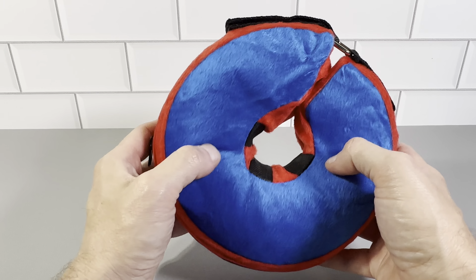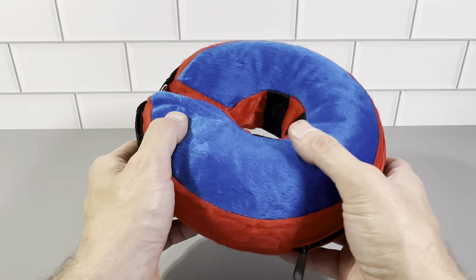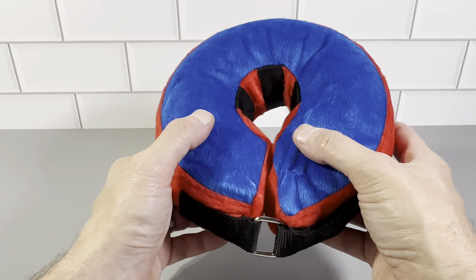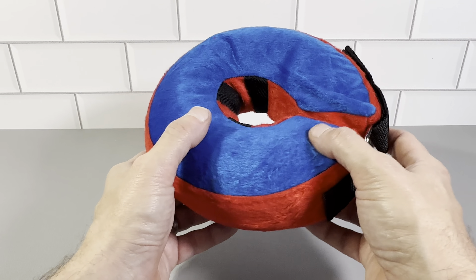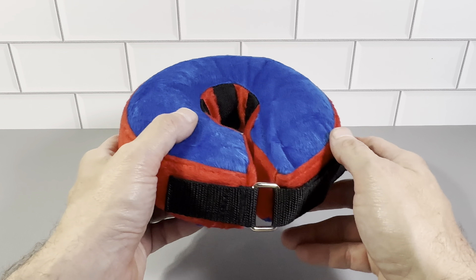This is the small size, which is for a neck range of five to eight inches. These dog collars are also made in medium, large, and extra large. The extra large goes up to 18 to 25 inches, so that's going to fit a very big dog.